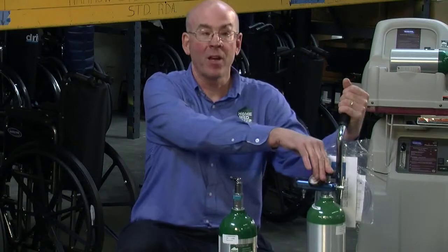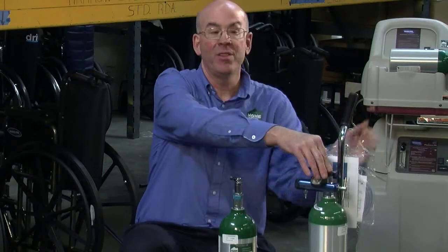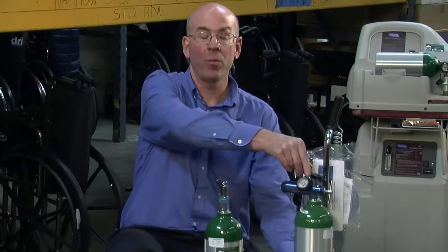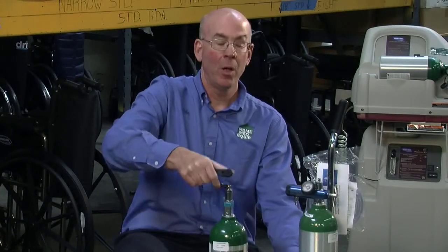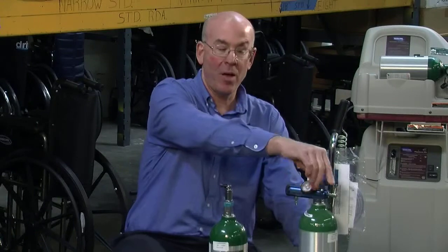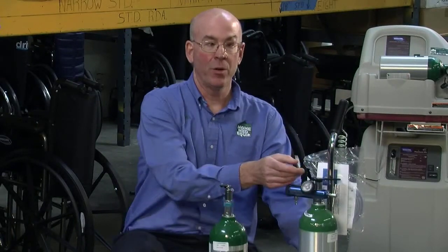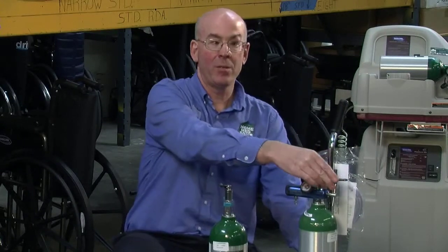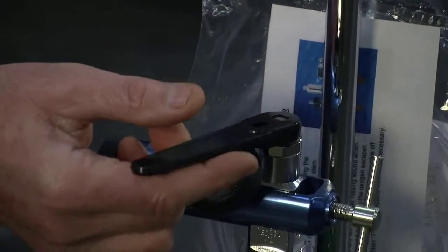To operate the oxygen backup system, you will open the cylinder by turning the wrench on top of the tank or the toggle counterclockwise to open. When you open the cylinder you only need to turn the wrench until it hits roughly half a turn to open the cylinder.